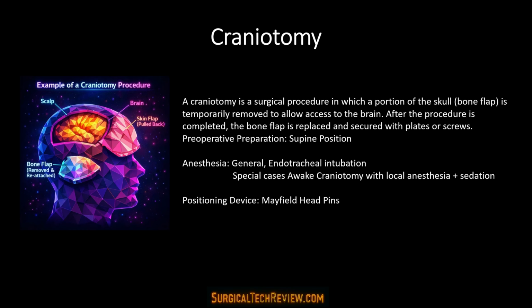Craniotomies are typically performed under general anesthesia with endotracheal intubation. In select cases, such as those involving speech or motor mapping, an awake craniotomy may be performed using local anesthesia and sedation. The patient's head is secured using Mayfield head pins. This provides rigid fixation and prevents any movement during drilling, which is essential for safety and accuracy.